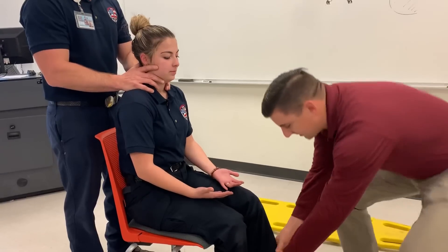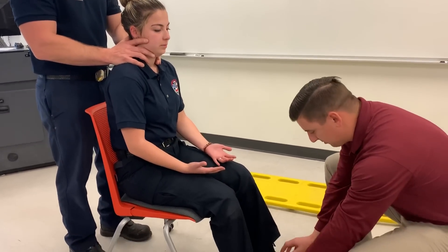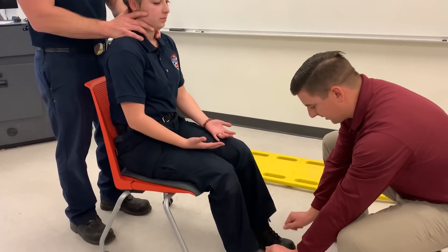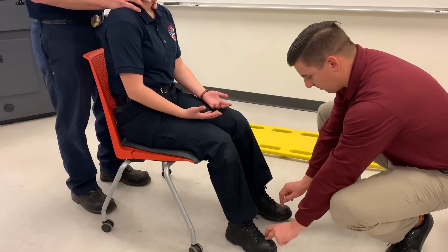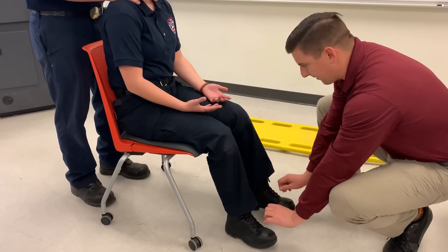You've got to do the same on the feet, of course having the shoes off. Pulse. Wiggle your toes for me. What toe am I touching? What toe am I touching? Cap refill.